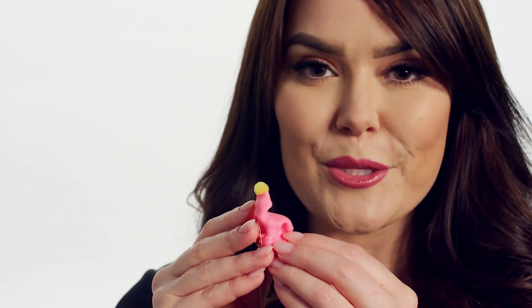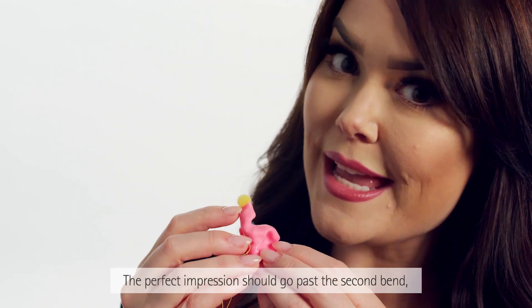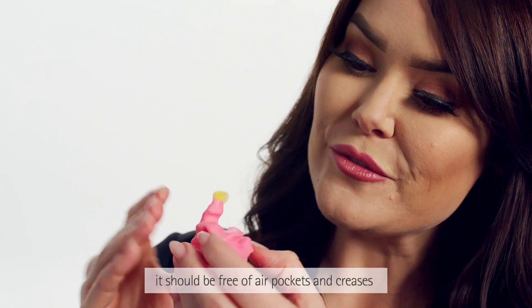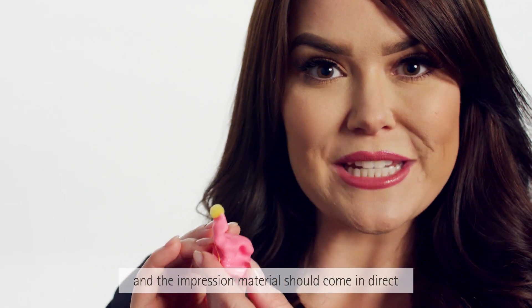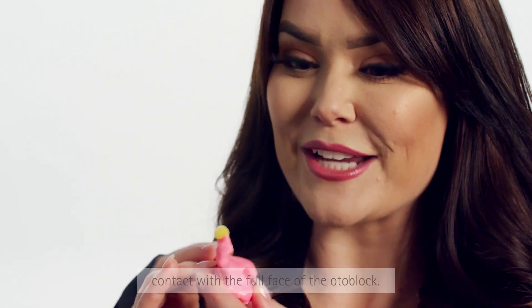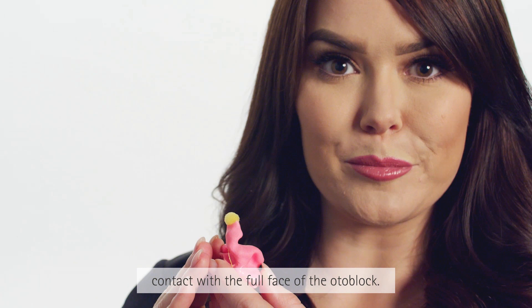Then evaluate your impression for accuracy. The perfect impression should go past the second bend, it should be free of air pockets and creases, and the impression material should come in direct contact with the full face of the Otoblock.